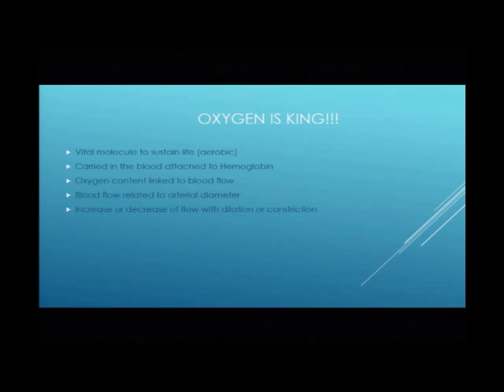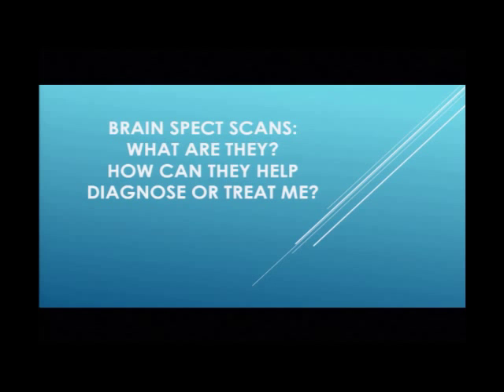And that's very important clinically because there's a number of conditions, including concussion, where there's a narrowing, probably due to a spasm of the arteries, that decreases the size and reduces the flow. And that's a problem. So what is the test that is used to measure the blood flow in the brain? It's called the SPECT scan. Of all the different kinds of scans, this is the only scan that can show the blood flow in the brain, and specifically it shows what's called the microcirculation.